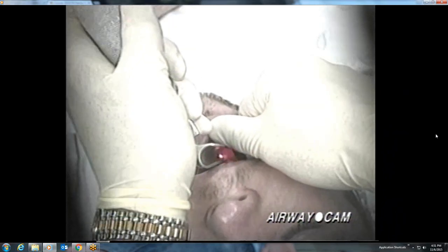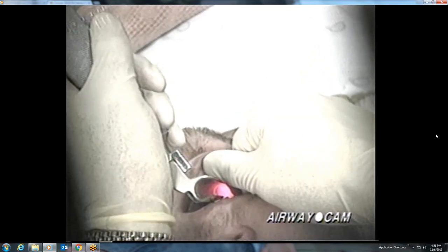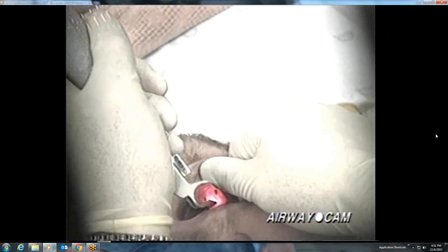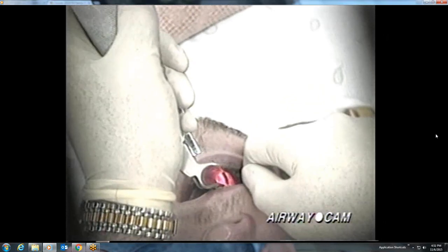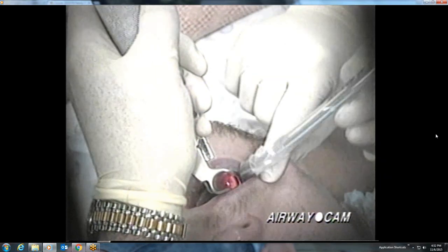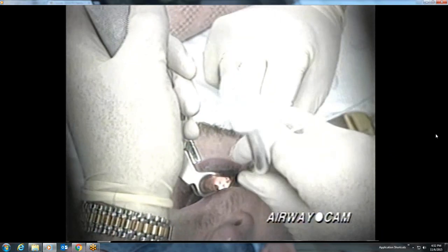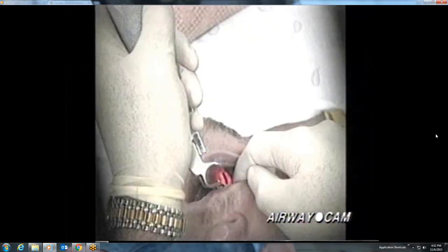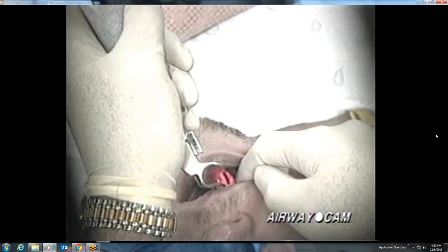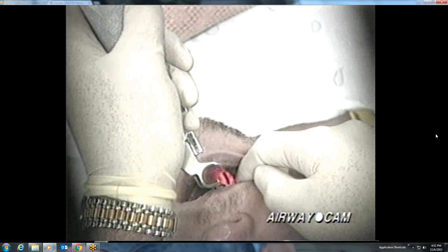Once the epiglottis is positioned beneath the blade, elevation in the direction of the handle results in a good view of the true vocal cords. The Miller blade, with its small flange, often provides a relatively narrow opening for visualization and tube placement. The tube is directed down the right side of the mouth so as not to block the target until the last possible moment. Note the small D-shaped flange of the Miller blade and the very vertical appearance of the vocal cords due to traction on the laryngoscope.